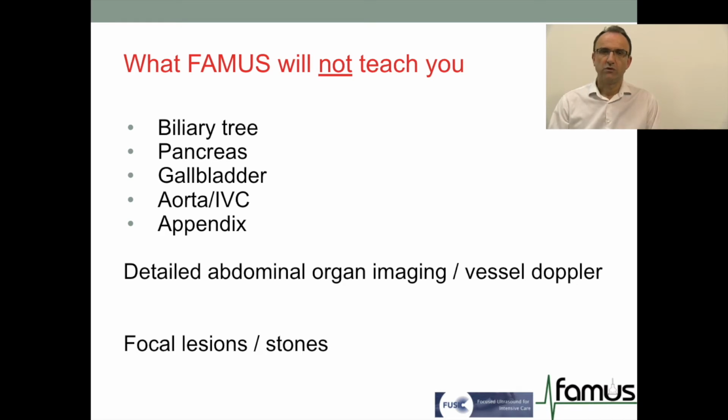And also to draw conclusions about the major vessels through Doppler imaging, and also to report about focal lesions of the liver, focal lesions of the spleen, and stones.